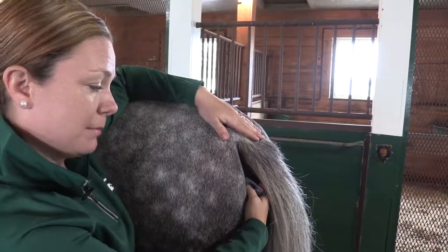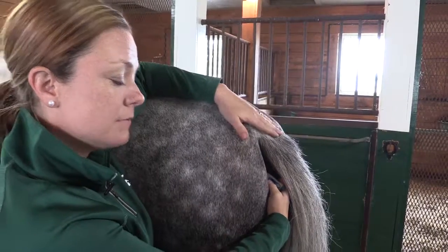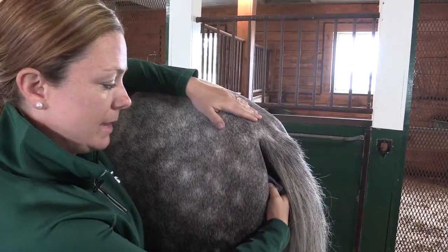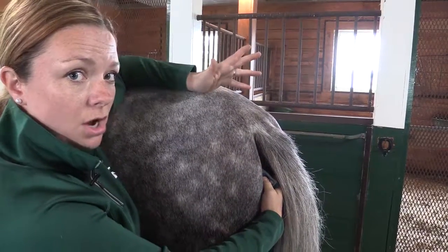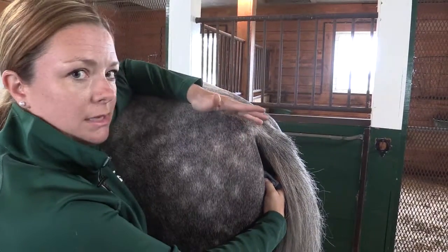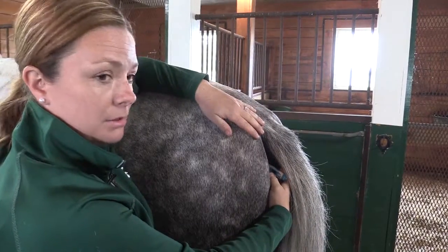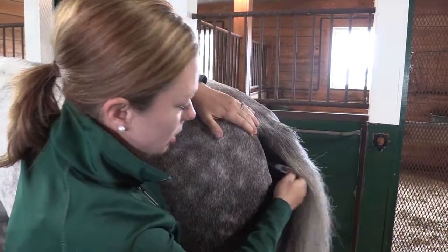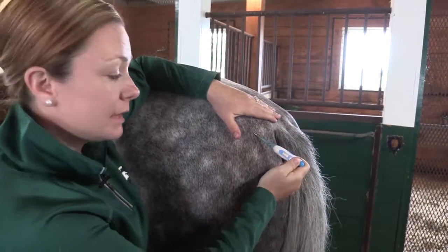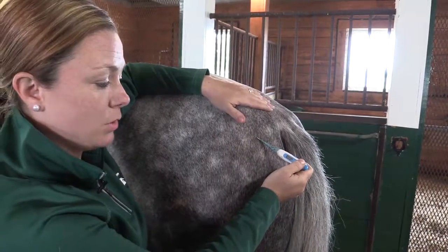While we're waiting for the thermometer to beep and complete taking the temperature, you'll notice that I continue to stand off to the side of the horse. You can even kind of pet them, scratch them, just let them know that you're back here — ideally still talking so he knows where I'm standing. I'm not concerned about holding his tail up; his tail is out of my way, and I'm just waiting for the cue from the thermometer that it's done. And there it goes — his temperature is right at 100, which is ideal. We expect his temperature to be somewhere between 99 and 101 for a healthy horse.